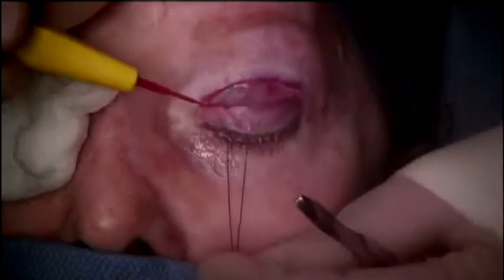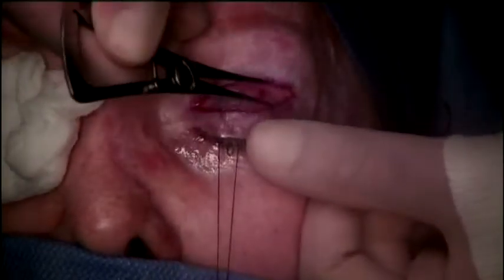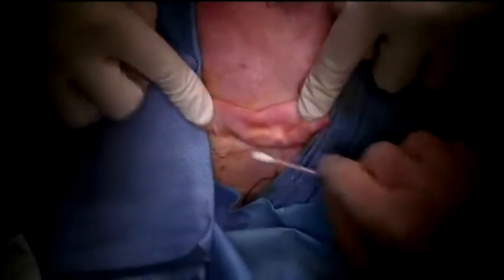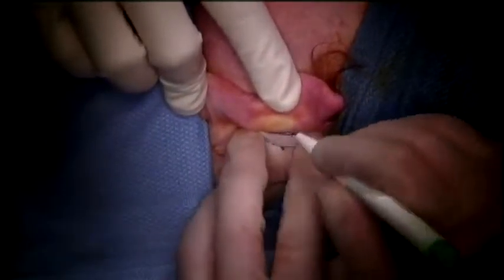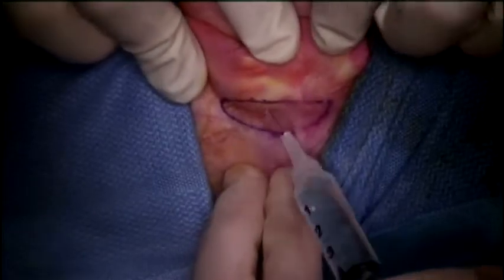So now typically I use a marking pen and caliper to make sure this is the distance that we need. For this patient, you can use a template. I use the suture paper template to take a drawing of it. And as you see on a post-auricular region, we're using a marking pen and transferring that into the desired section. Once you transfer that, you need to go ahead and inject the lidocaine, and with a 15 blade, remove the desired skin.